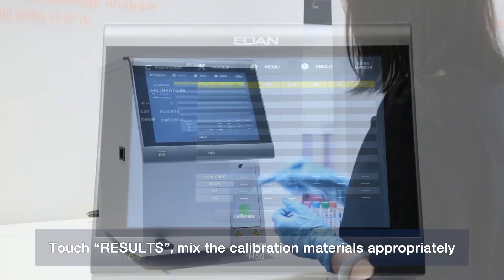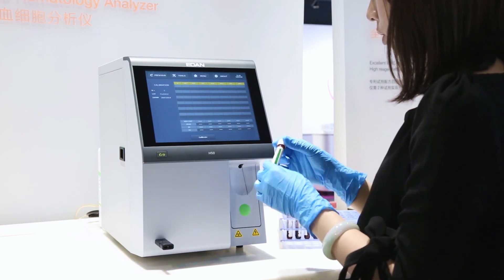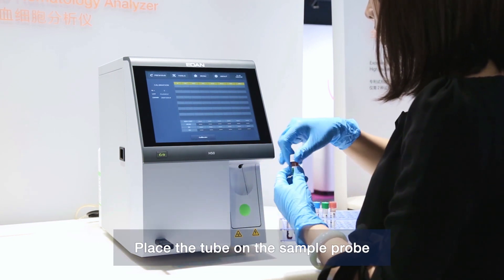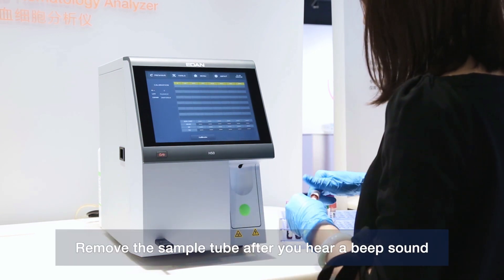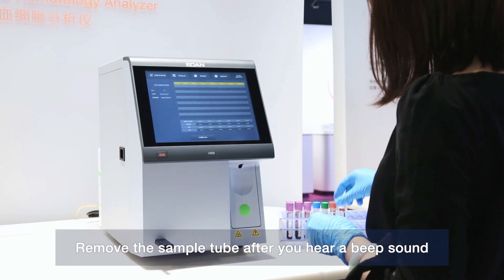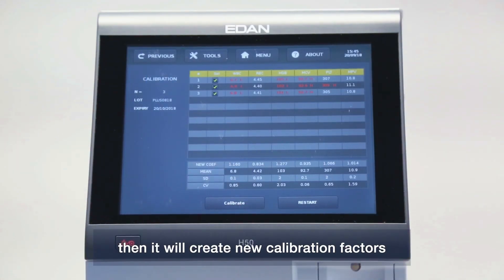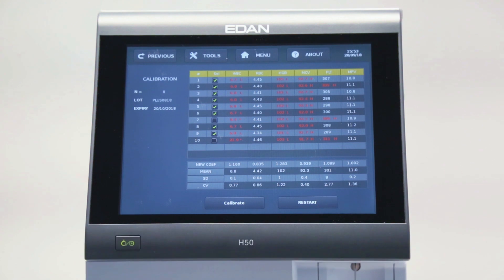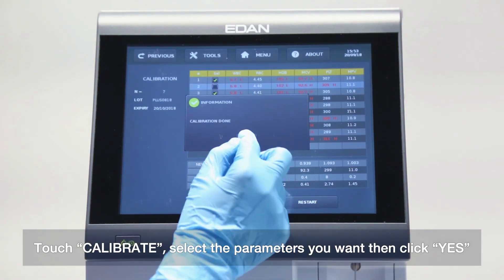Touch Results. Mix the calibration materials appropriately. Place the tube on the sample probe and press the sampling button. Remove the sample tube after you hear a beep sound. Test at least 3 to 10 times. New calibration factors will then be created — touch Calibrate, select the parameters you want, and click Yes.